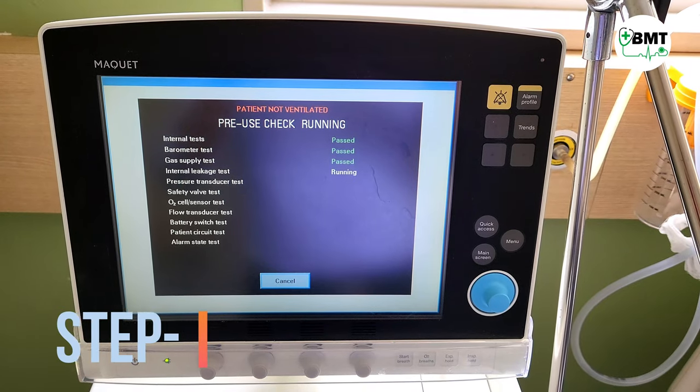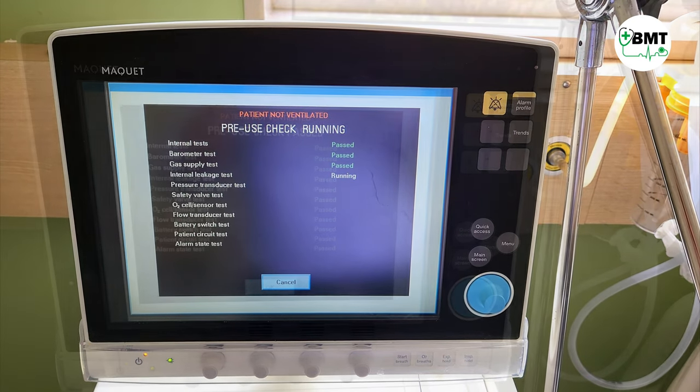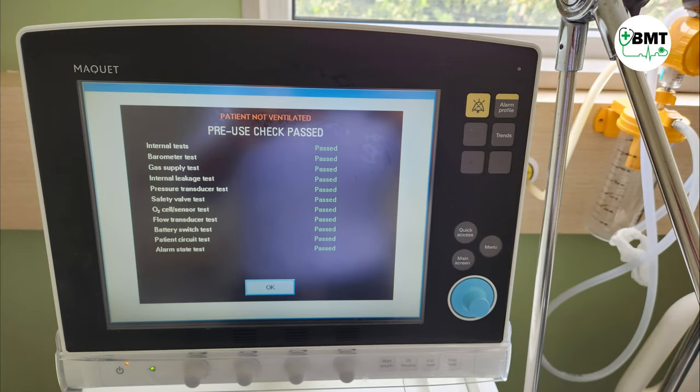Step 8. Perform an operational checkout to ensure the cassette is working fine. Once the operational checkout has passed, the ventilator is available for use.